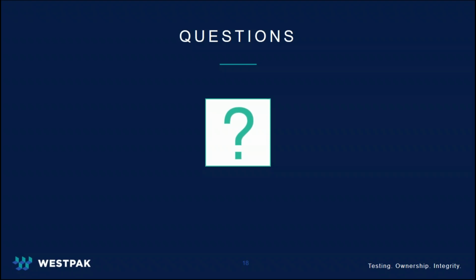Thank you for the question, Greg. A full channel, 100% of the seal, is required for it to be considered a failure per the ASTM standards. However, if there is a 25% or a 50% void in the seal, I would recommend examining your package system to find the cause of the voids. We also perform visual inspections for ASTM F1886, which is an inspection for seal integrity, completeness, and uniformity.